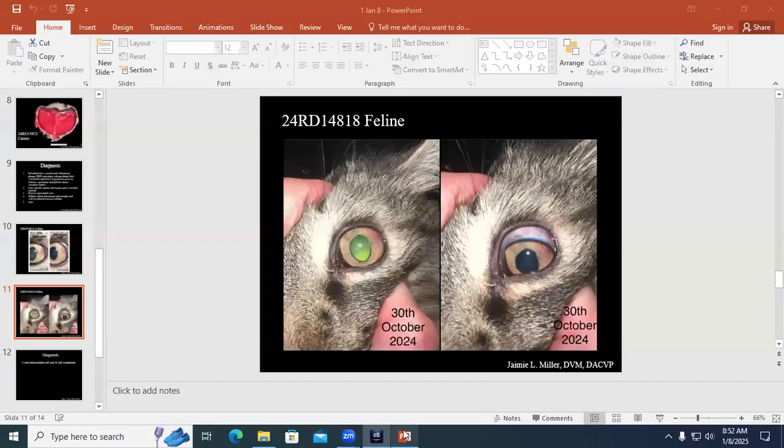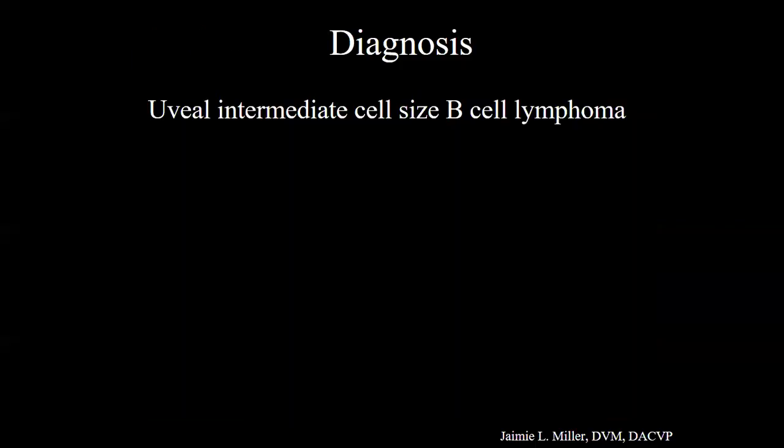Are you familiar with CD20 positive melanomas? Can you repeat that? Are we familiar with CD20 positive melanomas? No. Let's chat about that. All the other pathologists in here are shaking their heads no. So Dr. Gasper might have some interesting comments. No, it's... That would certainly make things difficult.